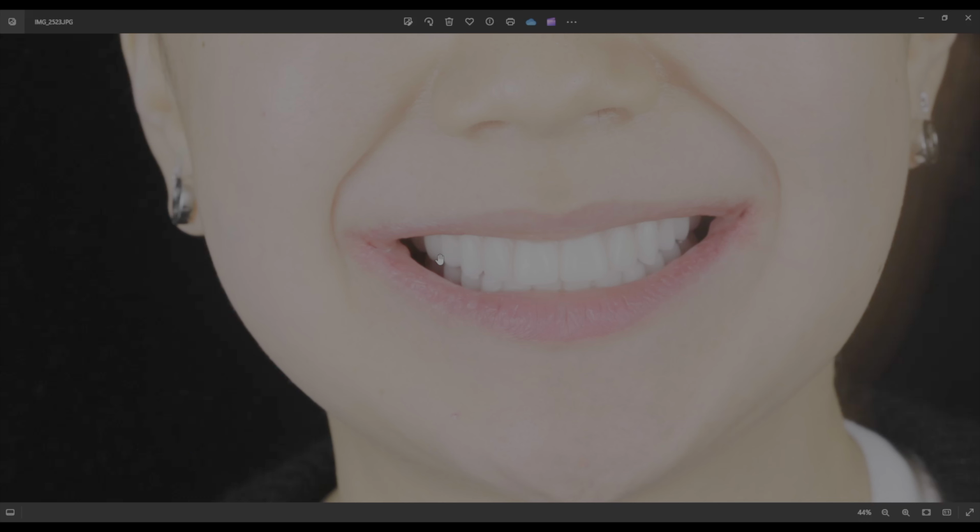So Dr. Koukousaki, you did a great job restoring this case. The patient was very happy. She's a little swollen in this because this was actually a photo from the next day. Do you have any other thoughts, Dr. K? No, I think the plan of getting more implants to support the teeth is not only going to prevent any breakage of the temporary teeth, but also the final zirconia is going to be fully supported. And later on, if she needs another implant on the other side, the surgeon is going to have the bone to support it.